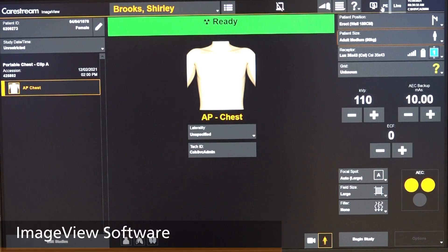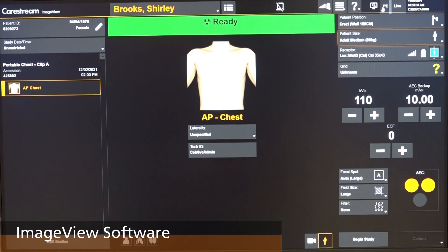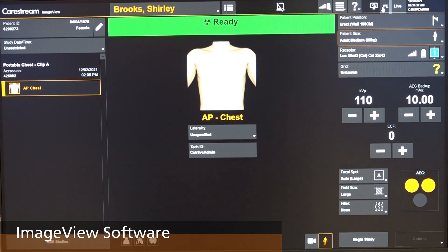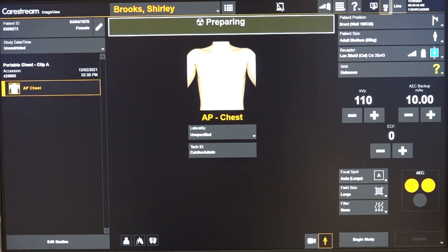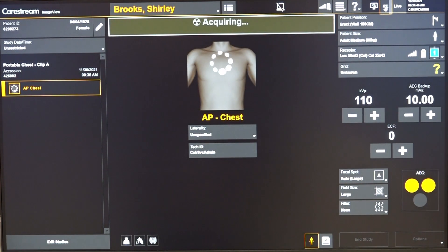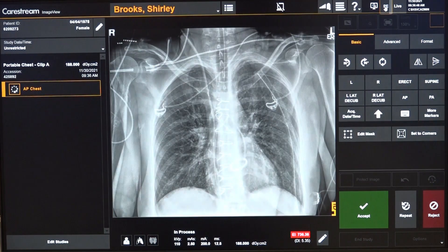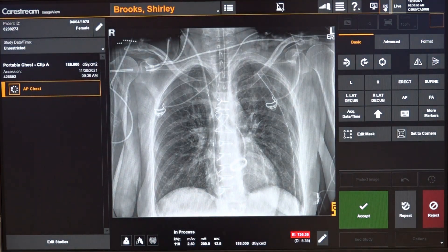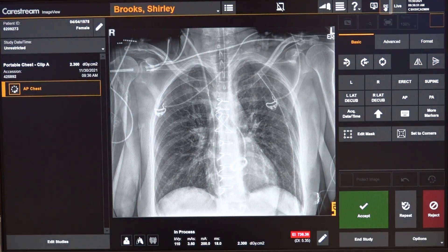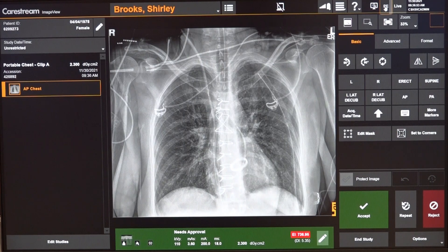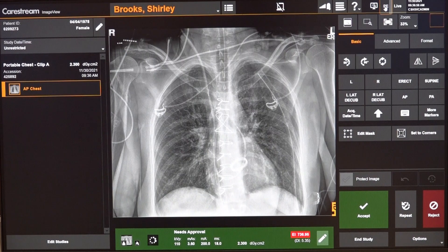Our image view software has a single screen workflow with the most common operations a single button press away. Additionally, our software automatically applies image processing looks based upon a site preference for consistent presentation. In this case, we've automatically applied the preference looks and also automatically generate companion views, as you can see on the bottom.